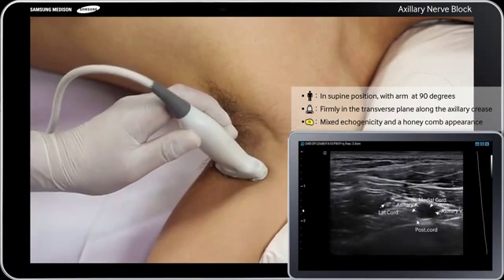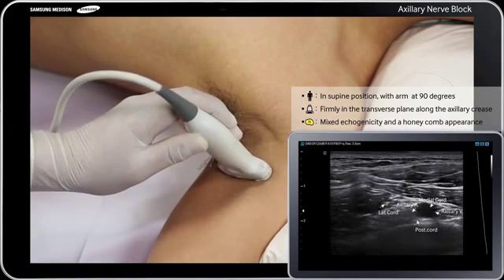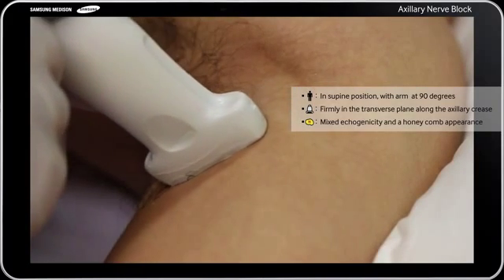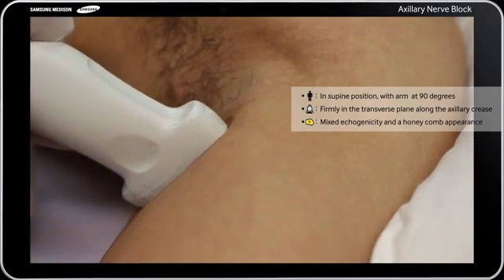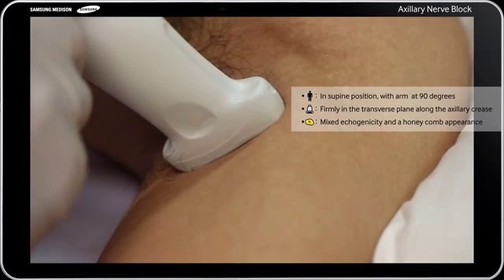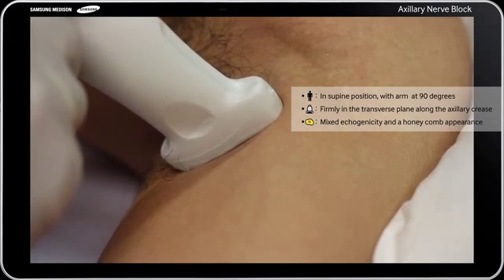Visualize the median, ulnar, radial, and musculocutaneous nerves in the transverse view. Nerves in the axilla have mixed echogenicity and a honeycomb appearance. The nerves are round or oval and are located next to the axillary artery.